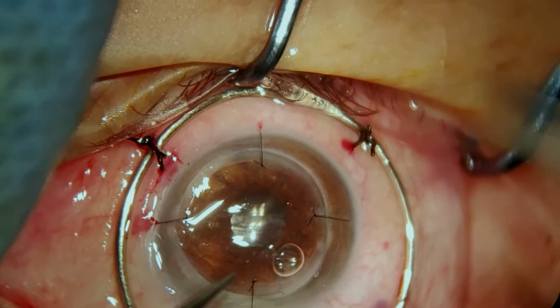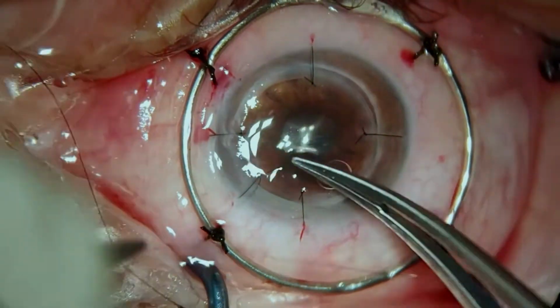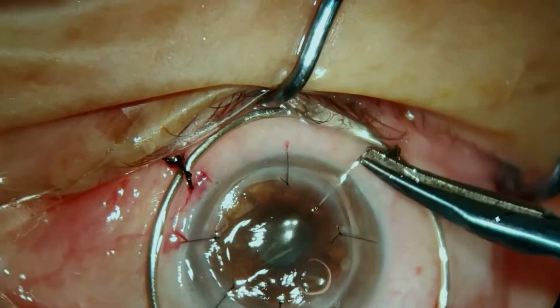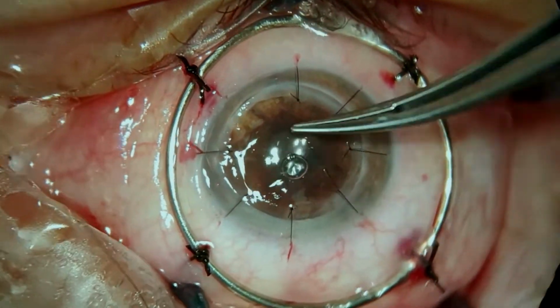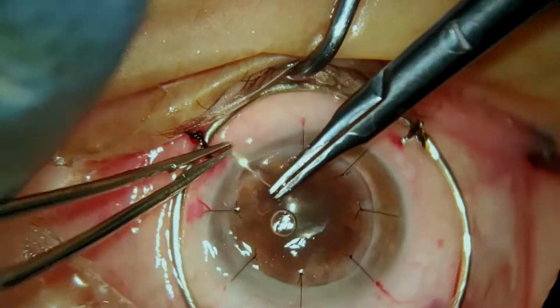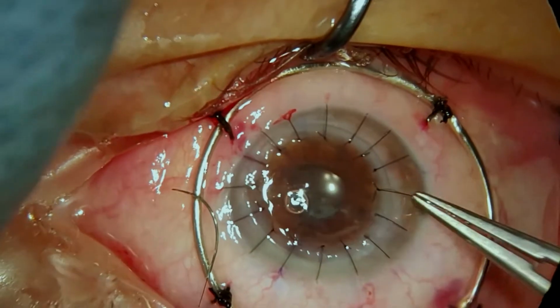Now moving forward, after the first 4 sutures, in a PK, you have to put the next 4 in as well if you plan on doing a running stitch immediately. It's not wise to start a running suture after the first 4. You should do it after the first 8. Then you can start a running stitch. Whereas in DALK, you can start a running stitch after the first 4. So what we usually do is end up using 16 interrupted stitches.